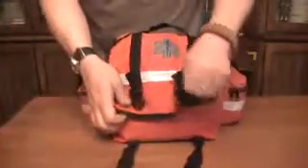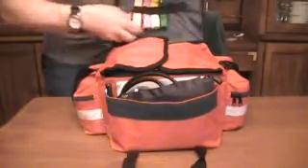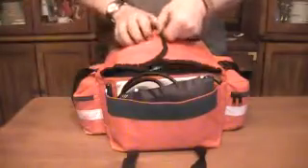Remember, anytime that you are in a first aid situation, the three things that you need to worry about are airway, breathing, and circulation. So I have a couple of things in here that start with airway, including, you can see it at the top of the video, oral airways. That's something that the average person is probably not going to have in their kit. I have it because I'm trained in how to use them.